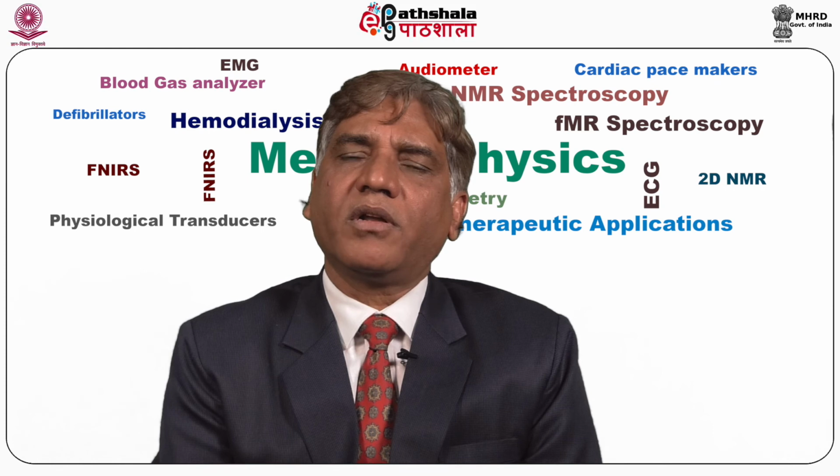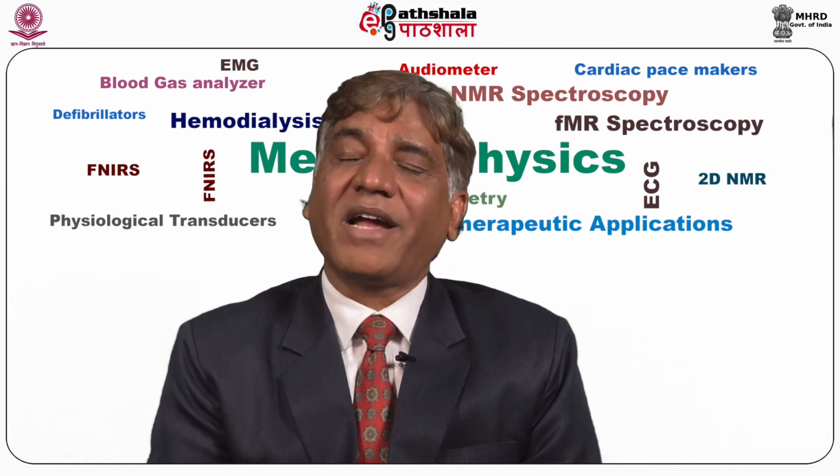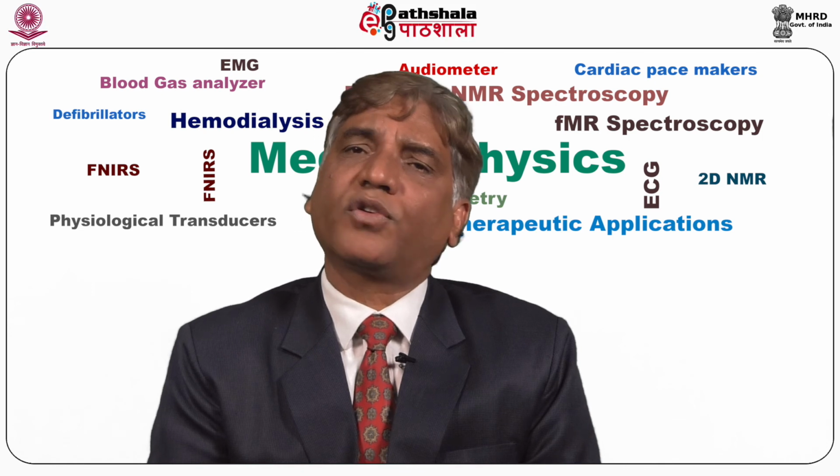This is what is called the return of longitudinal magnetization. Longitudinal magnetization is returning from minus Mz to plus Mz through 0.